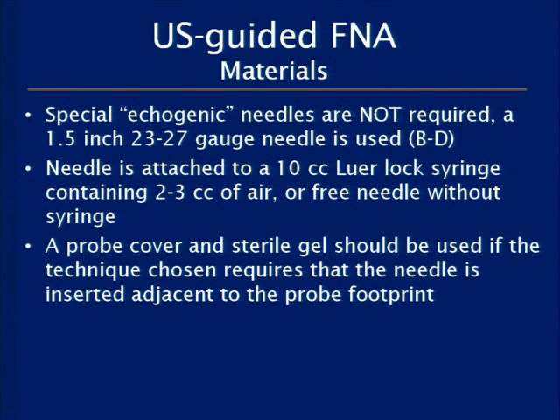We generally will break the seal and put a little bit of air into the syringe. Depending on your technique, you need to use a cover of the probe and sterile gel if your needle is going to be really close to the probe. If you're able to do the biopsy such that your needle's a little bit further from the probe and not going to come in contact with the gel, it's not necessary. So it really depends on what you're doing.